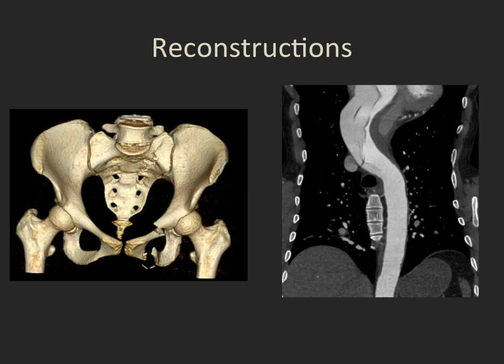On the left is a 3D reconstruction of the pelvis in a patient with multiple complex pelvic fractures. This image can be rotated and manipulated for the orthopedic surgeon to plan surgery. On the right is a multi-planar reconstruction to look at the thoracic aorta. The technologist has laid out the aorta from the heart down through the diaphragm, and this is a patient with an aortic dissection, allowing us to see in one image the plane of that dissection from the ascending into the descending aorta.